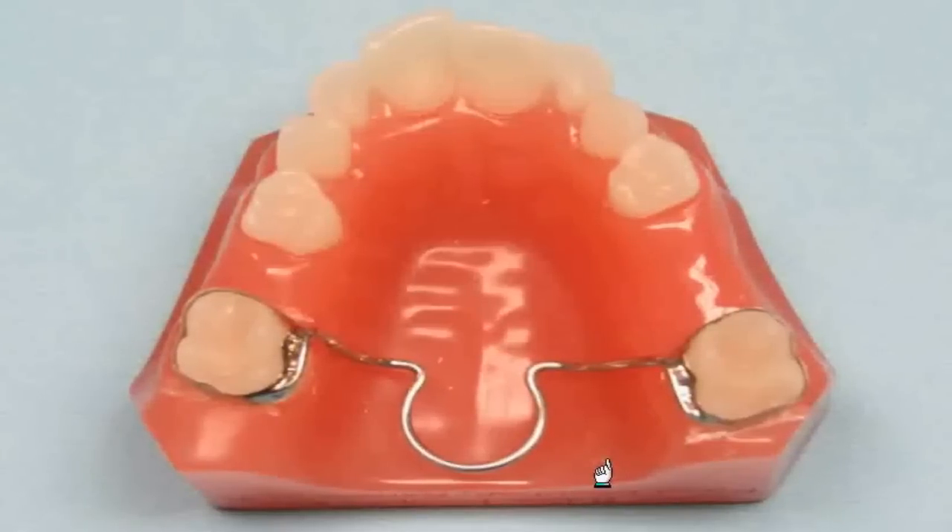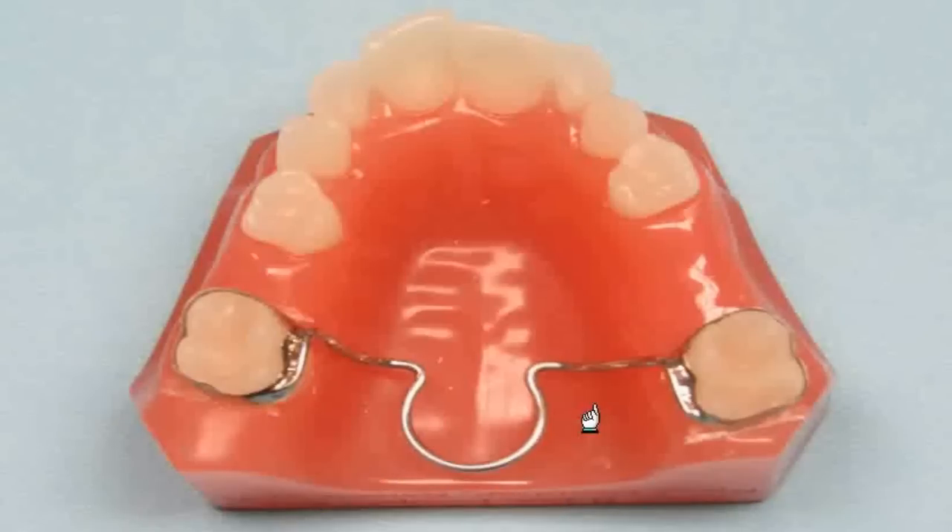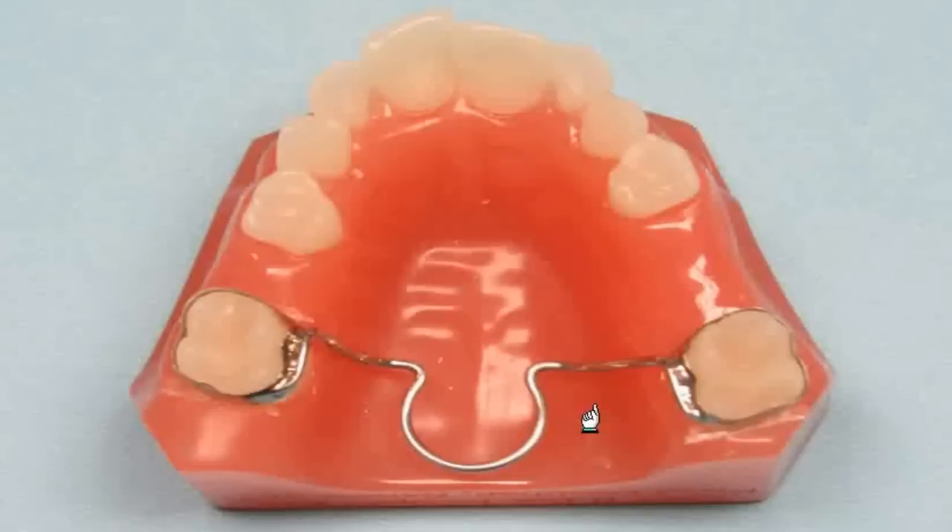For long-term wear of an upper space maintainer, you may want to consider a transpalatal space maintainer. This appliance has bands on the first molars and a wire with a loop across the palate. By linking the two molars together, you will create an anchor that will prevent the molars from being able to drift forward. Even though there is nothing in the anterior region, the molars will not move. We always contour the wire as close to the palate as possible to keep it out of the way of the tongue and make the appliance as comfortable as possible for the patient. This appliance is great for long-term wear and can be a better option than the Nance appliance.